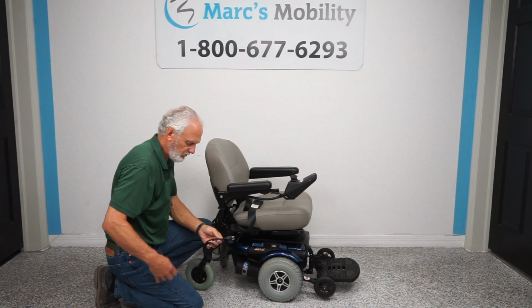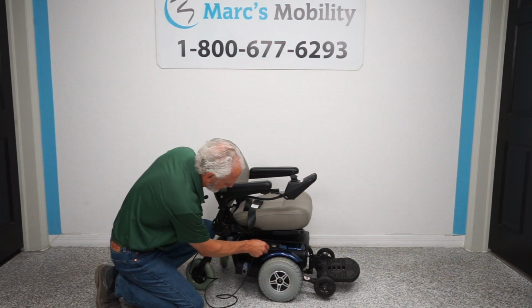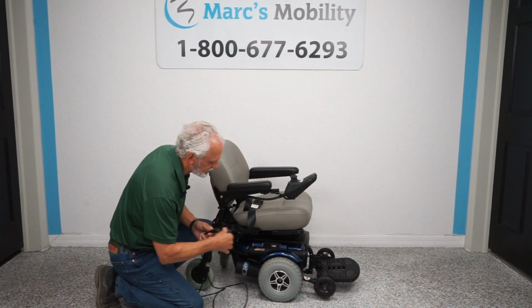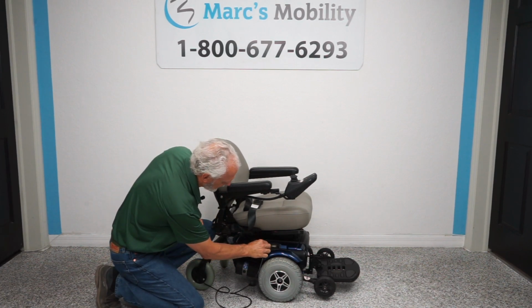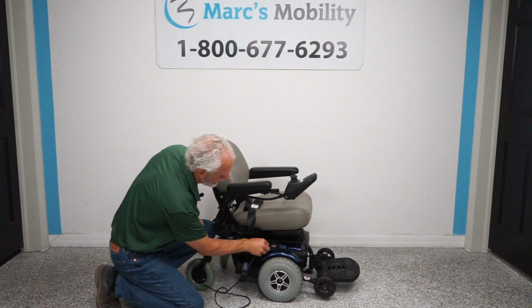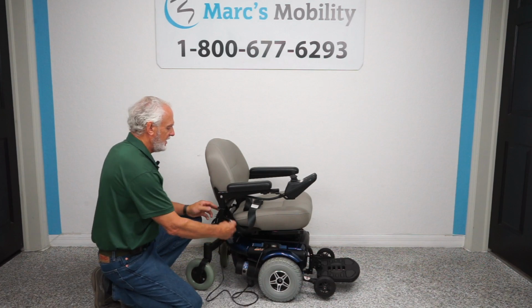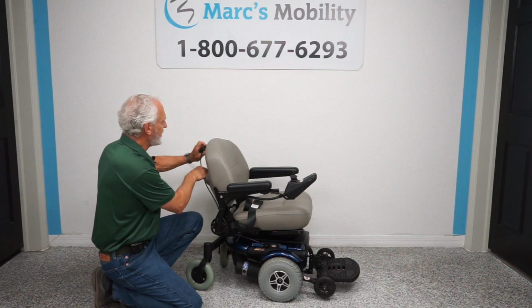There's a built-in charger in this chair. Now, this chair, the only thing you have to do is plug the charger here. Not the charger, but the cord. The charger is inside the chair. Put the cord in here. I'm half blind, folks. That's what happens when you get old. You need, there we go. You need glasses. All you have to do is keep the cord in here.